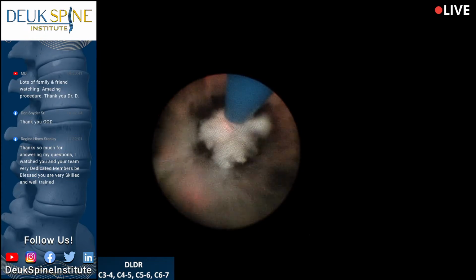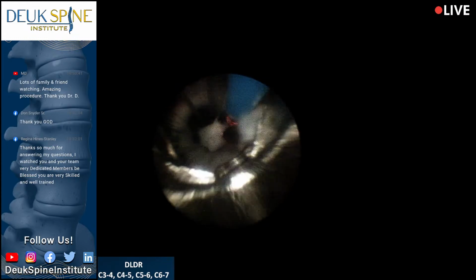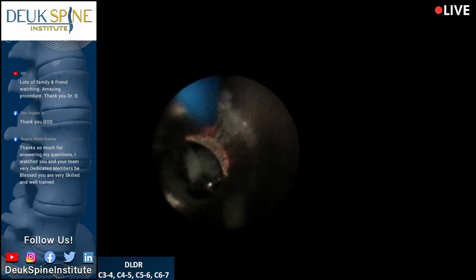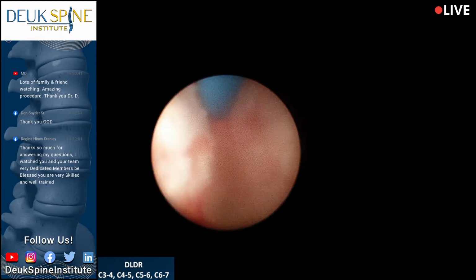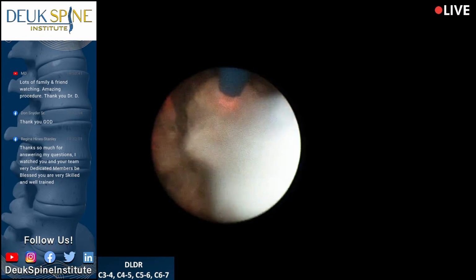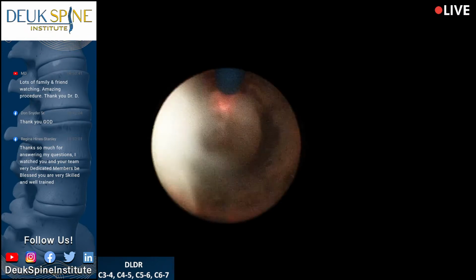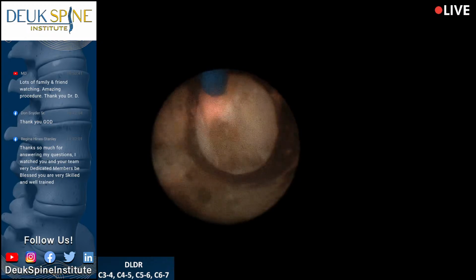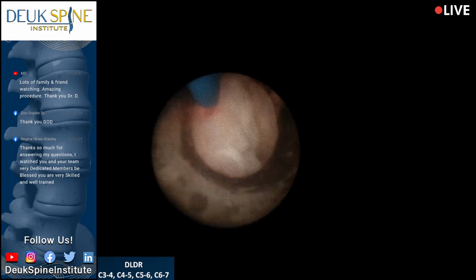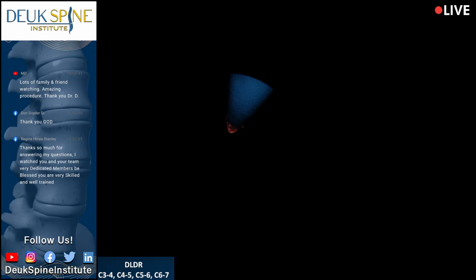And what's happening is as I'm doing that, I'm removing all the scar tissue and bone spurs that are basically holding the bones together, almost like cementing them together, sort of like rust will hold 2 metal plates together and keep them from moving. We all know what rust is. Rust is something that forms over time. Yeah, it's like environmental inflammation. I like that, that's a great description. So this is like damage to the disc that then causes all this reaction back here. And the reaction is what we call inflammation. That reaction is actually what's causing all the problems for the patient, usually.